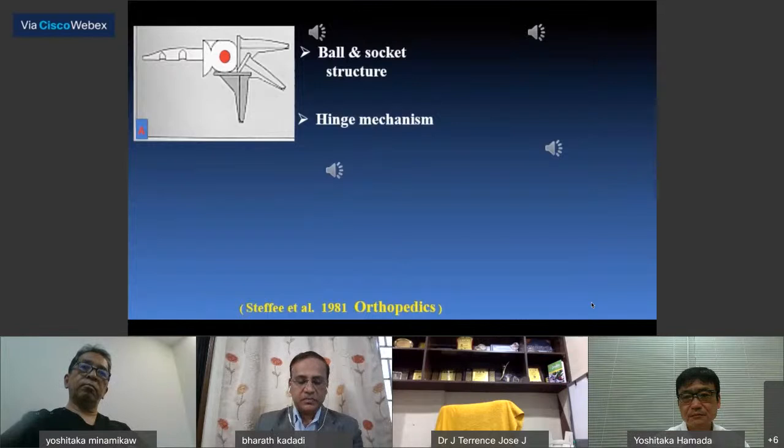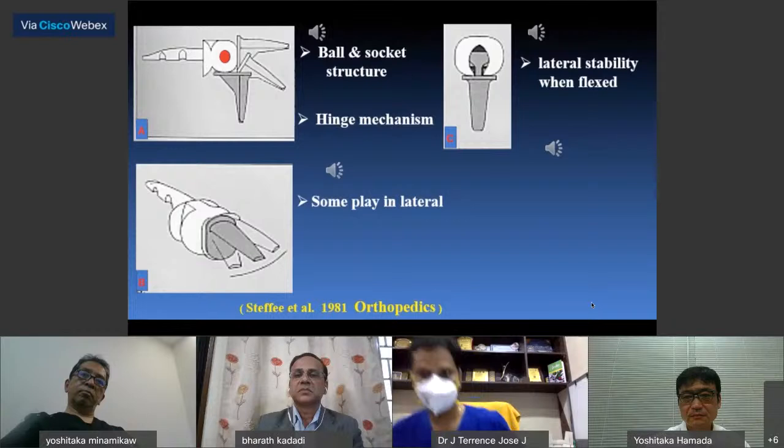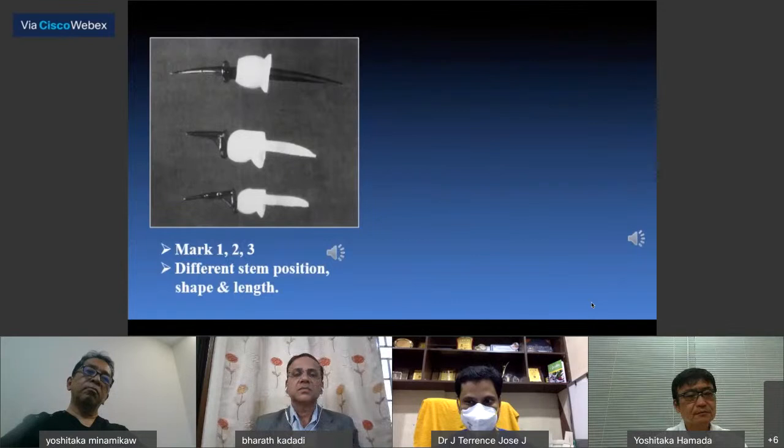It had a ball and socket structure, but a hinge mechanism with a single axis. There was some play in the lateral direction, which provided lateral stability when the joint was fully flexed. The offset joint helped flexor and extensor strengths. Three modifications, Mark 1, 2, and 3, with different stem position, shape, and length, were made in a short interval.